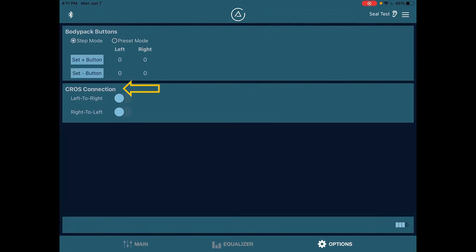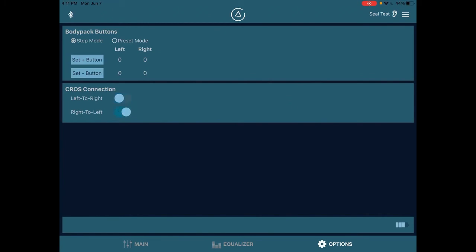Right below this, we see cross connection. That stands for contralateral routing of signal. This is used by individuals who have single sided deafness. Perhaps they have a music induced hearing disorder in one ear such as distortion or pitch perception issues. What this does is it takes the mic input from one ear and reroutes it to the opposite ear. So if I select left to right, the microphone input from the left earpiece is going to be rerouted to the right earpiece and I'll hear it through my right ear. I can also do that for right to left.